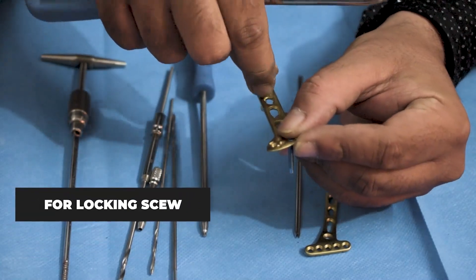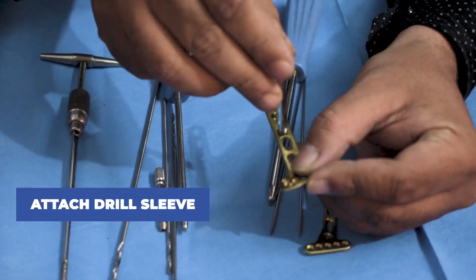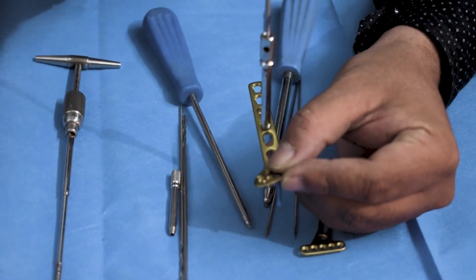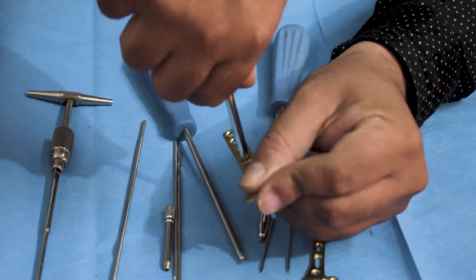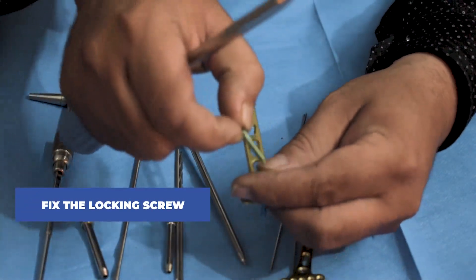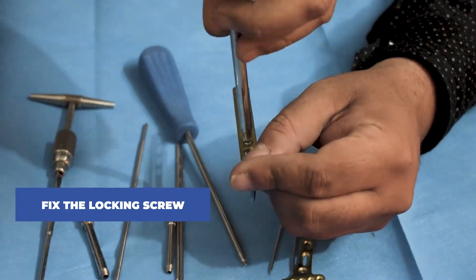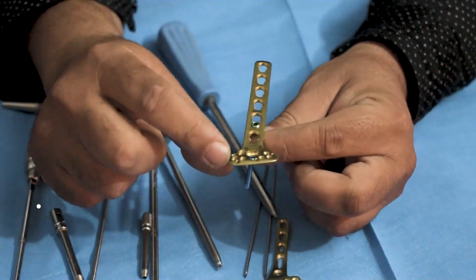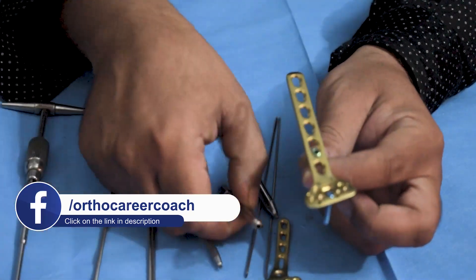In order to use a locking screw in the shaft region of this plate, we repeat the same process. First, we attach the drill sleeve in the locking hole and drill through the sleeve with a 2.8mm drill bit. After drilling, we remove the drill sleeve, then the locking screw is attached to fix the plate. Tapping is not required in case of a locking screw. Drill bits and drill sleeves are used as per the size of the screw to be attached.